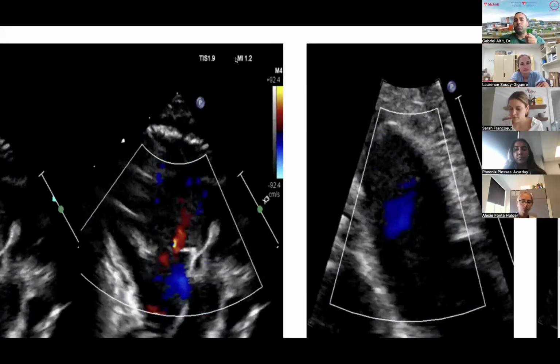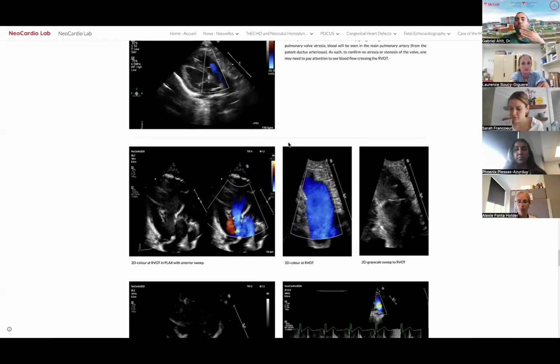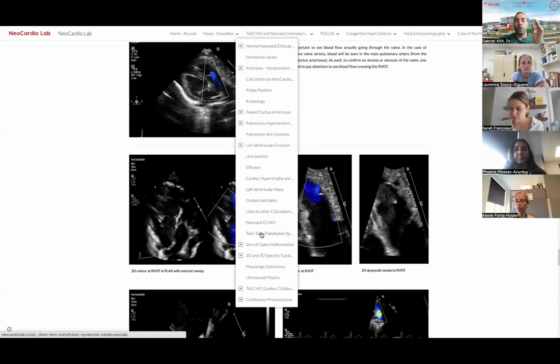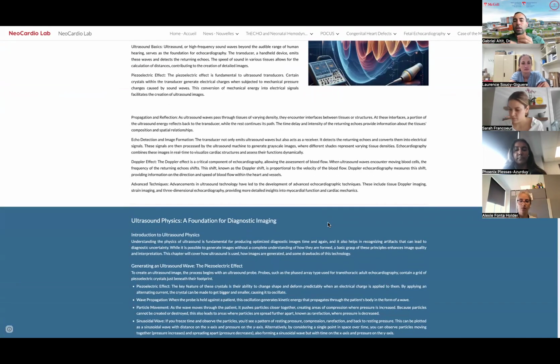The last thing I want to point out is a concept about how ultrasound is generated. In ultrasound physics, the machine will generate a current and pass this current through what we call piezoelectric crystals, which create the piezoelectric effect.